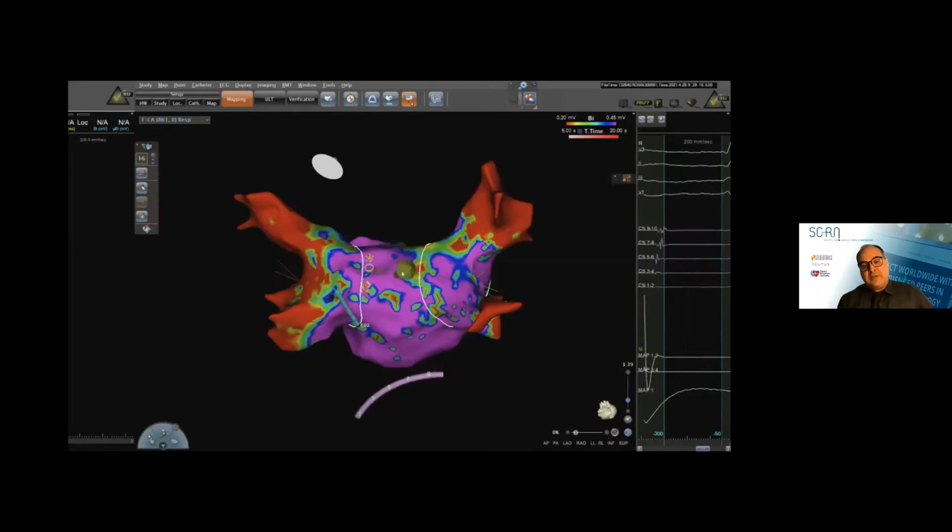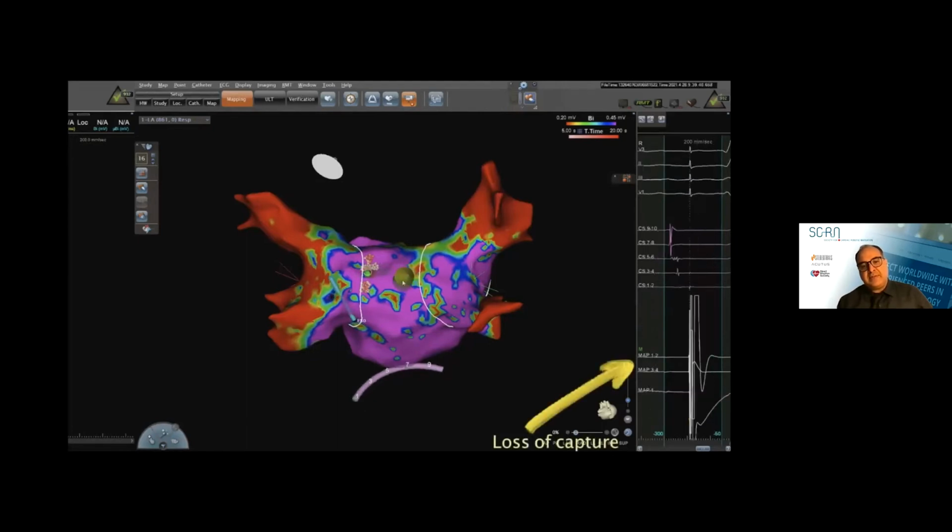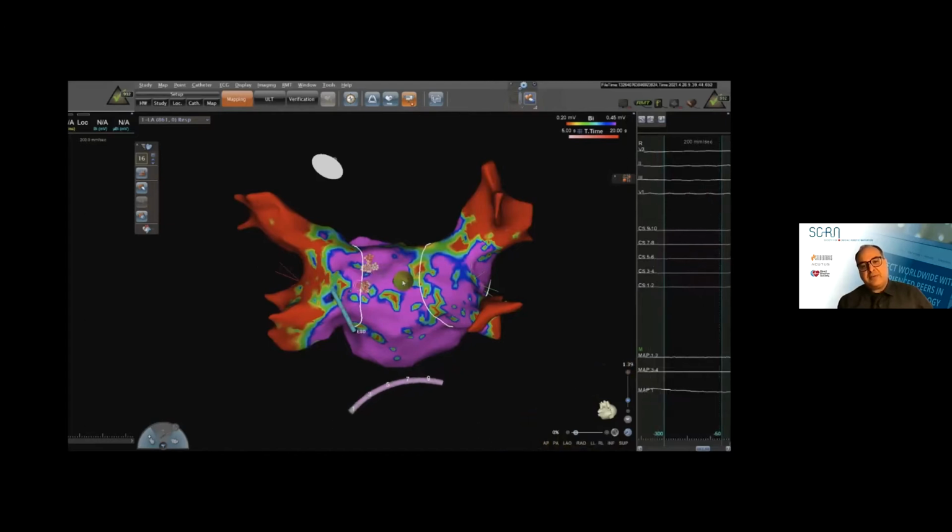If you decided not to pace from the ablation catheter, I would still suggest maybe pacing from the coronary sinus. It definitely increases the stability of the catheter and reduces some of the cardiac motion. Now, sometimes you may not lose capture because we're pacing at a high output of 20 milliamps or 10 milliamps, and you're capturing adjacent tissue. In those cases, when you ablate just above and below and you come back to that point, you will lose capture. Nonetheless, at every single point, I have to confirm that the capture is lost.